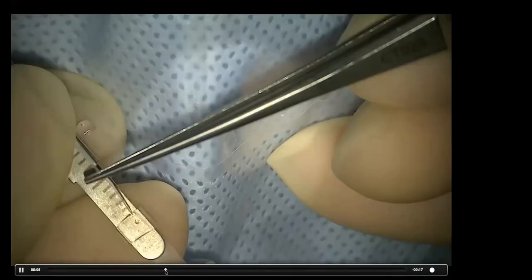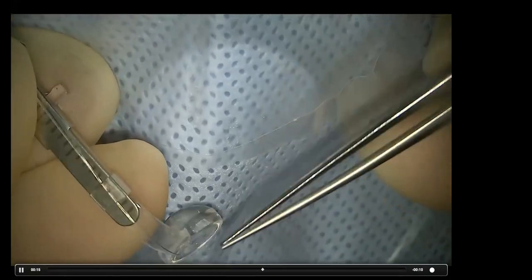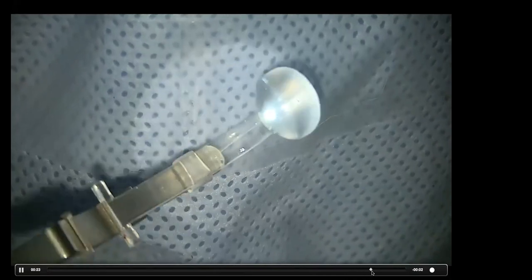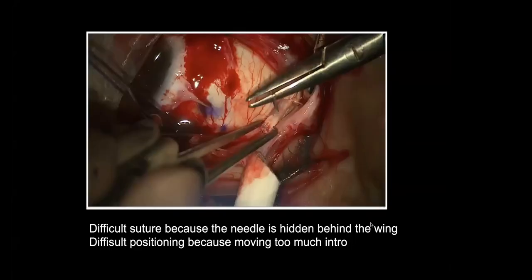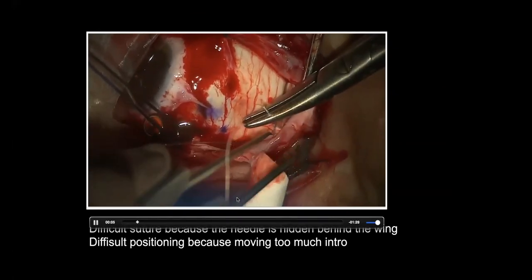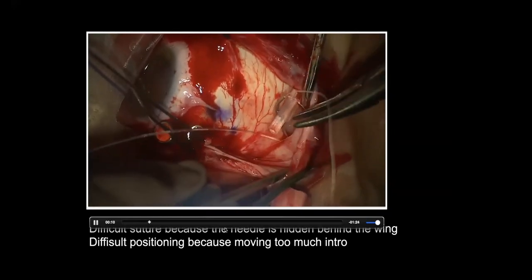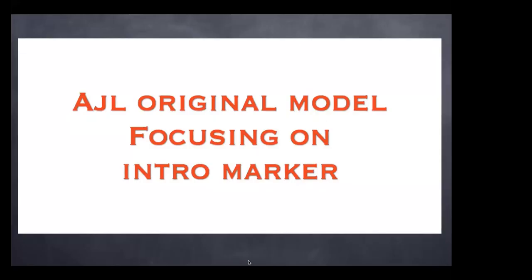See, this is the light that can be inserted behind the macular buckle. The metal instrument is a loading device that I designed to make the implantation easier. Again, even with this type of buckle, I thought that it was not so easy, because you cannot see the tip of the needle while you pass through. And it was difficult to position the buckle because it was moving a lot.